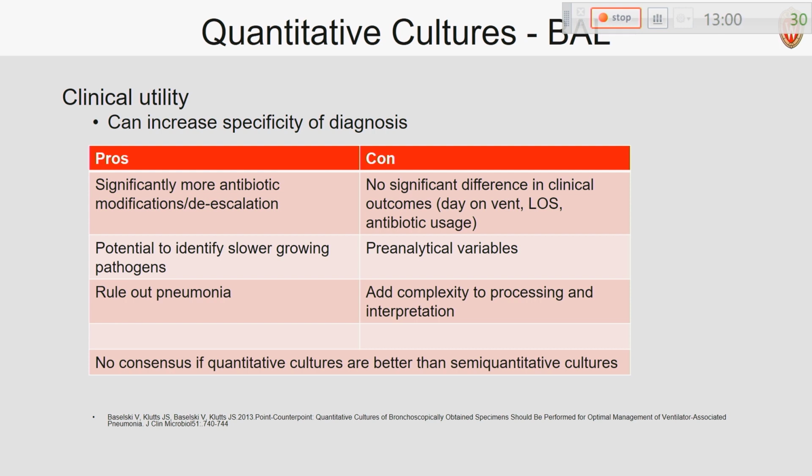So yeah, we have done them forever, and I haven't looked at that literature in quite a while, so I don't know what populations it was shown to be effective in. But I think of it the same way as the reason we do a quantitative urine culture: there was a correlation made with these opportunistic pathogens that are colonizing as well.